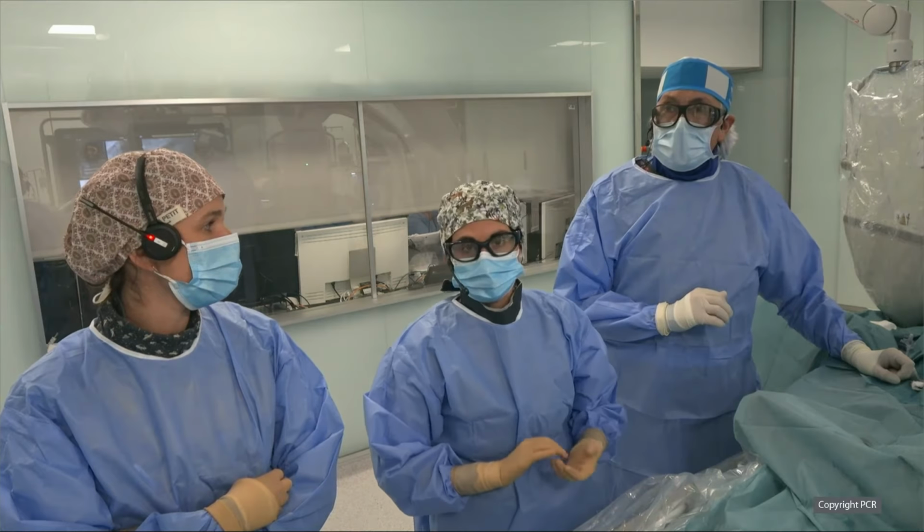There is one additional advantage, and it is the trifurcation. In the trifurcation, your burr is going straight to the carina with this large obtuse marginal or intermediate branch. So we believe that by making selectively backward sanding, we have less chances of causing damage to the carina between the circumflex and this intermediate branch.